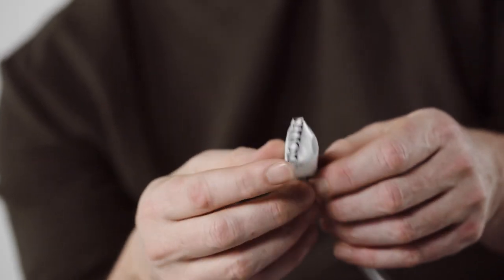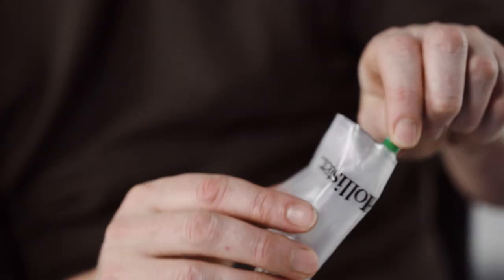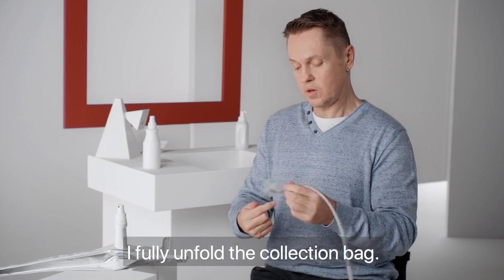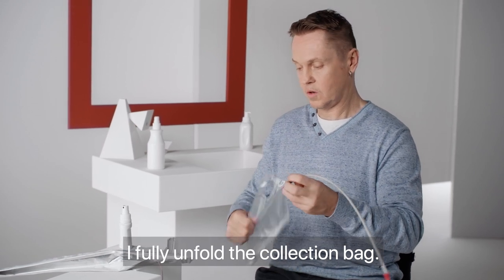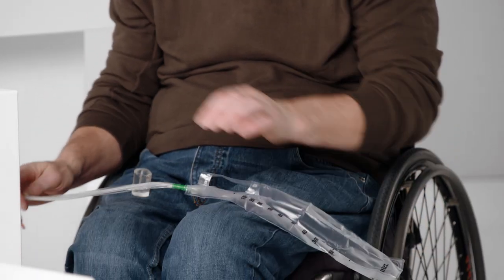If you're using Vapro Plus with an attached collection bag, hold the catheter in one hand while pushing the bag away from the catheter with the other hand to break the paper band. If I use Vapro Plus with the bag, I'm going to open the bag completely.